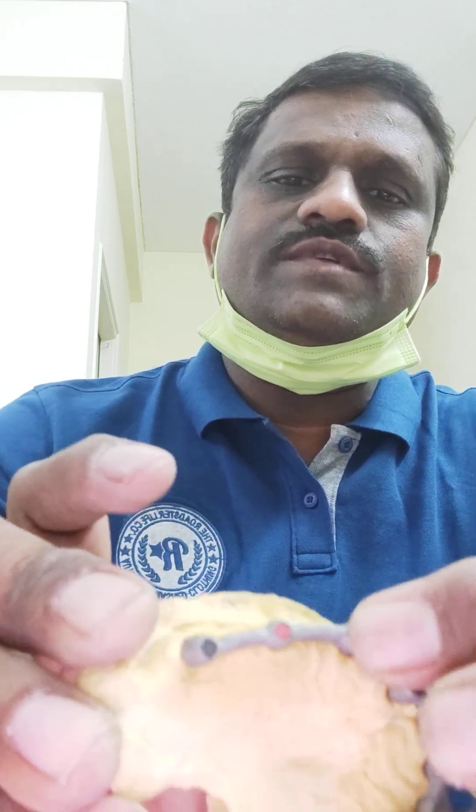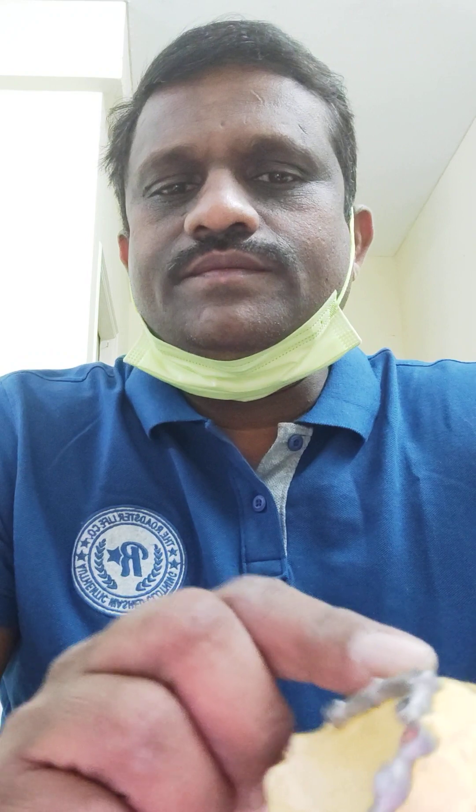The same thing applies in the second quadrant. In the second quadrant, there are implants one through five — there are ten implants total. The patient was using a denture before for almost 10 to 12 years. In the second arch, we start inserting from the back implant — the last one, which is in the molar area. Insert it here, place it, can you see? Then push it in. Now it's fitted. This is the upper one, and the undercuts in the patient's mouth will also need to be addressed.